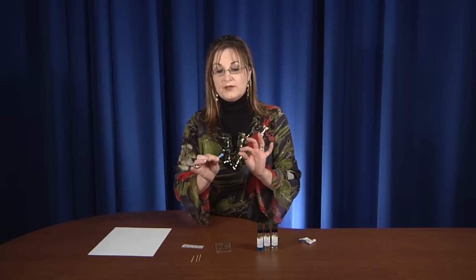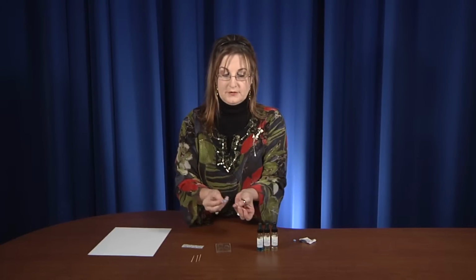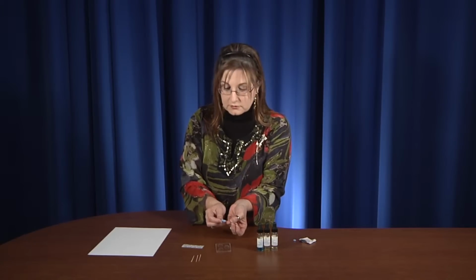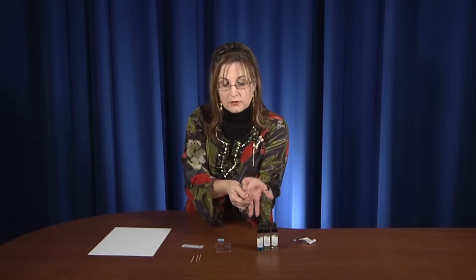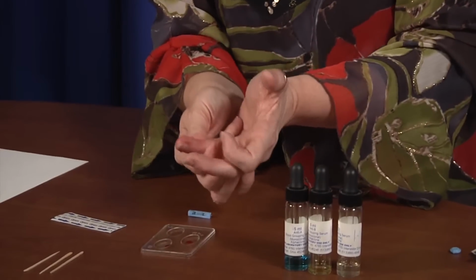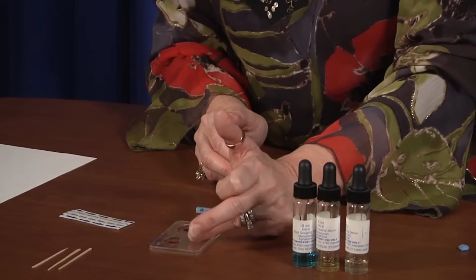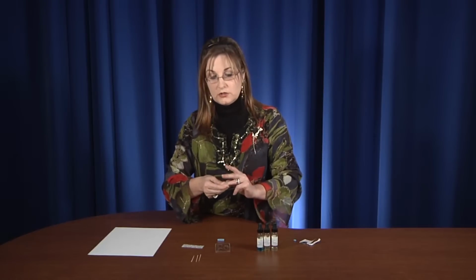If you have this type of plastic lancet, you simply twist the top off, and then you have your sharp. Now, bear with me. It's going to take me a couple of tries. I told you it's not easy to do this. And you want to poke your finger. You start getting a little bit of blood. You may want to milk it a bit and put the blood into each of the wells. Now, it's very important that you put the blood in first so that you don't transfer your antibodies from one well to another. Now, I typically clot pretty quickly, so I'm not going to put the Band-Aid on. I'm just going to wipe the blood off and continue with our demonstration.